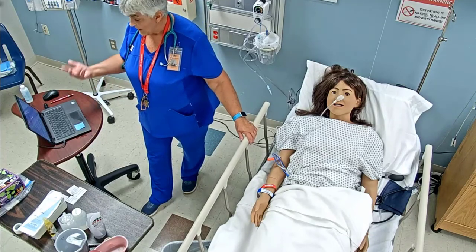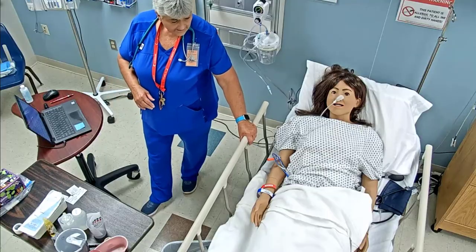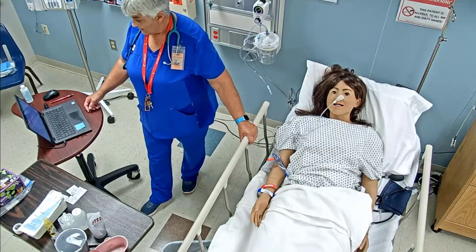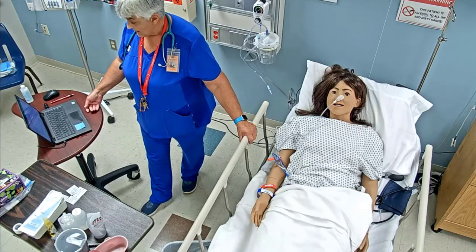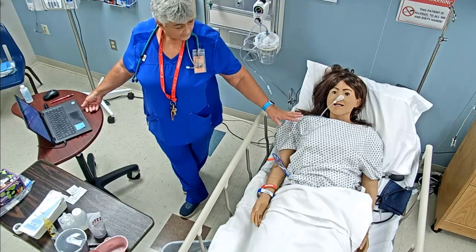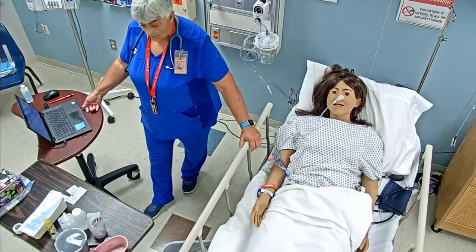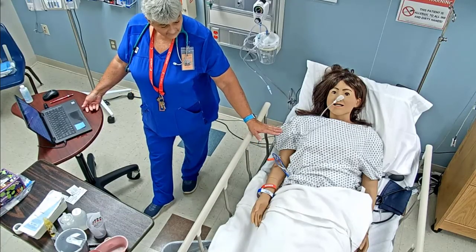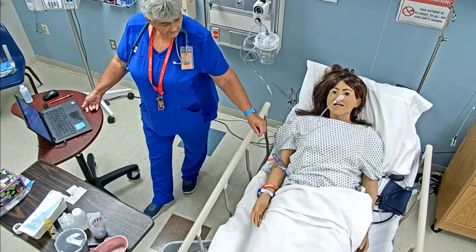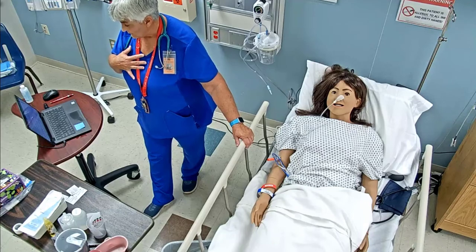We assess the pain, so we would document the pain before. Our assessment before was respiratory and abdominal, looking for any signs of possible aspiration, which we didn't have any with this one. So our expected was we were able to get the NG tube down. We didn't have any unexpected. She didn't have any problems with the swallowing and again respirations.